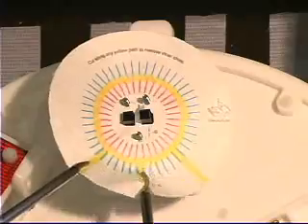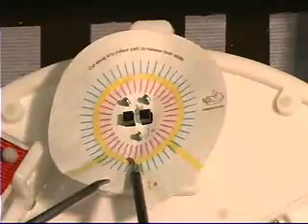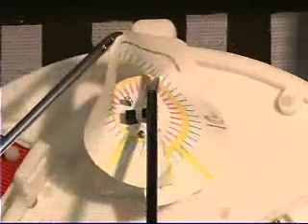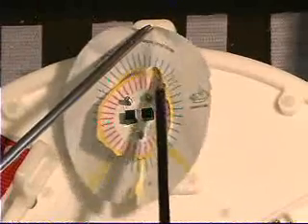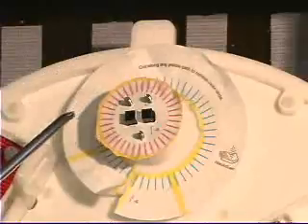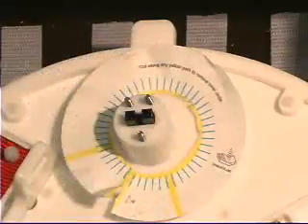The operator must cut through the yellow line and cut the circle as accurately as possible. The operator can choose to use instruments in either hand and can switch instruments as they see fit. Once the circle is cut, it is grasped with 2 forceps and lifted gently from the pod. Once it is removed from the pod, the task will be sensed as completed.